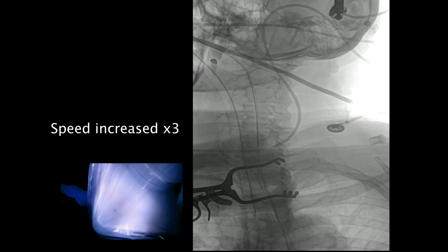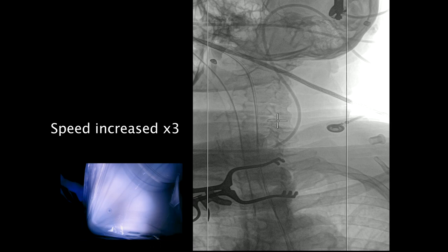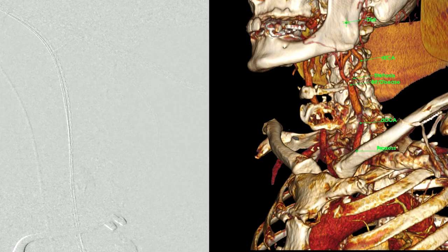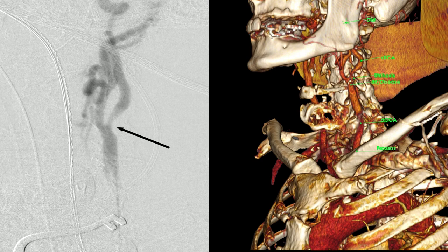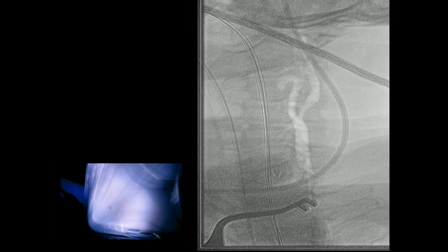Then the image intensifier is brought into the field. An angiogram was obtained to visualize the bifurcation and the lesion at the origin of the internal carotid artery.